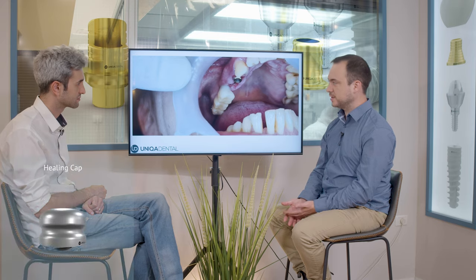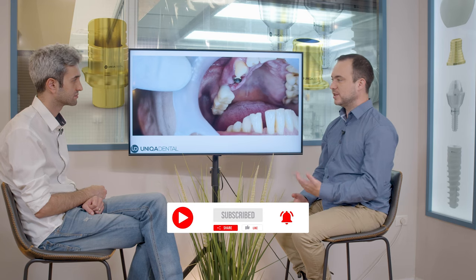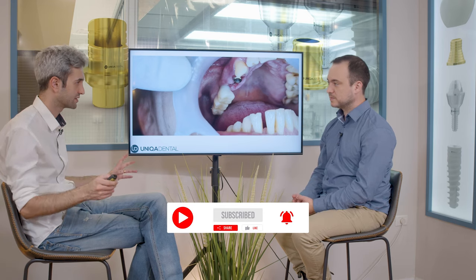When you already have two osseointegrated implants and add one more implant to them, you can reduce the crown height on this implant and the forces on it will be a little bit smaller — thanks to the height of the crown. This is the bridge we had before on those two osseointegrated implants. We added one more implant with a healing cap, and we want to immediately load this implant along with those two implants with one bridge. One unit, one bridge.